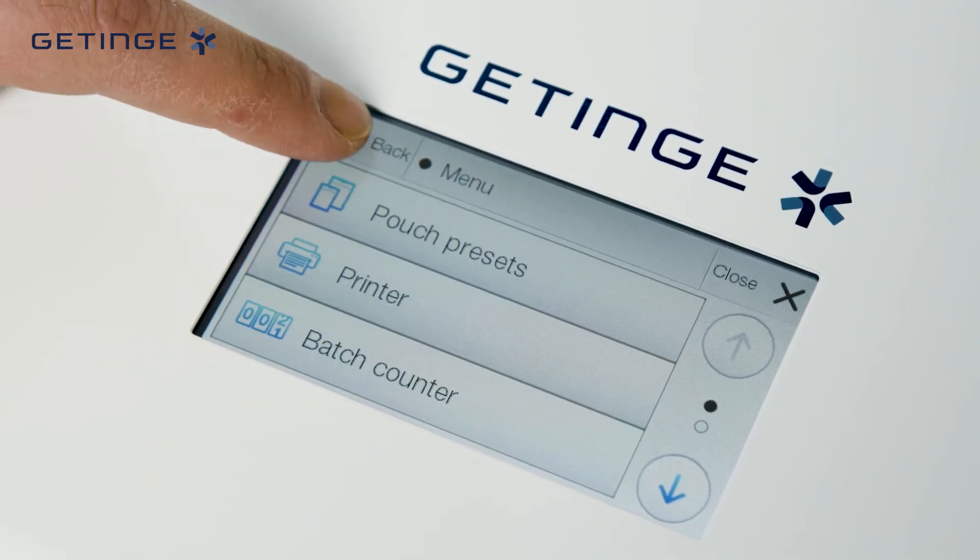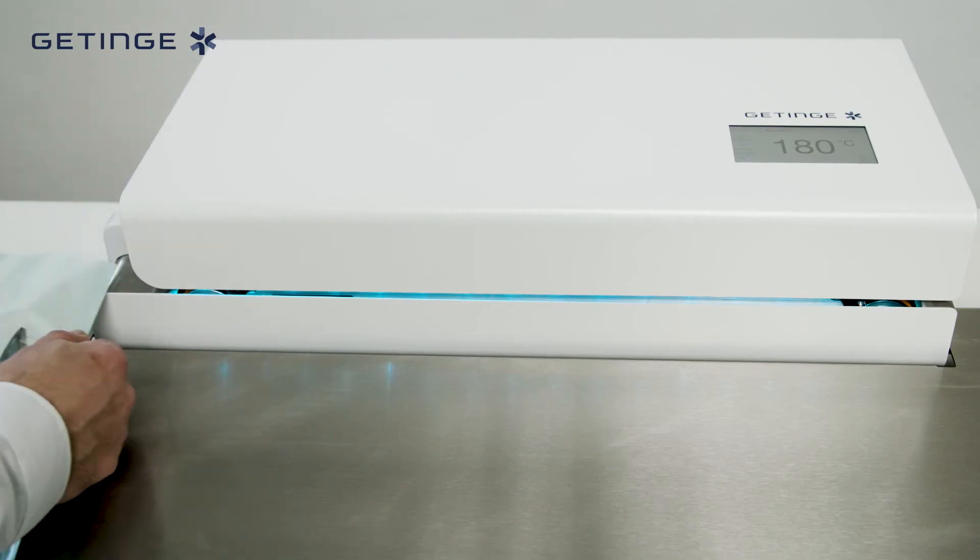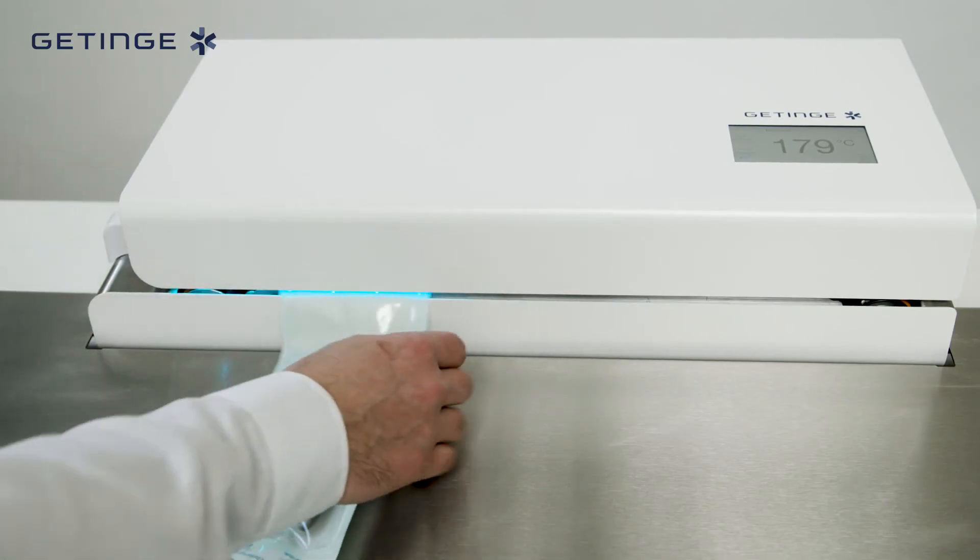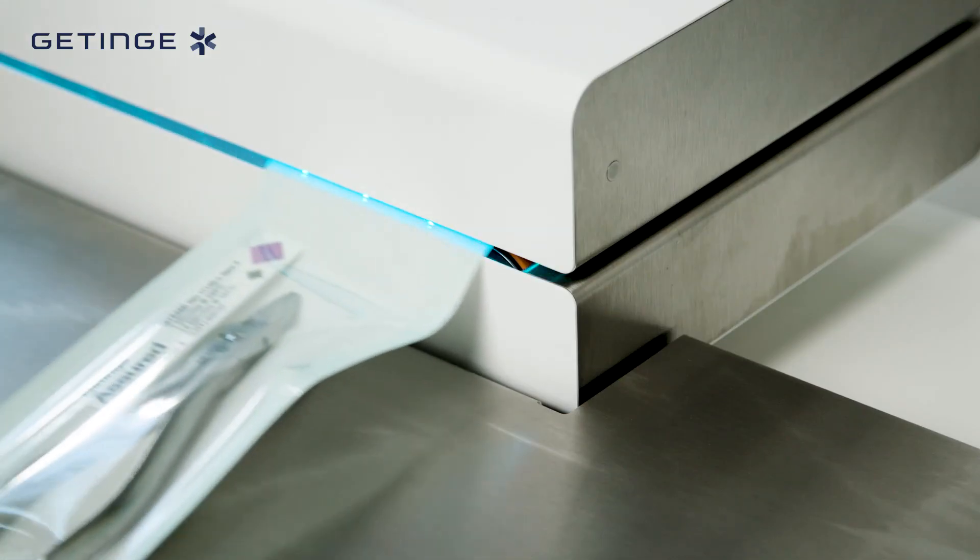The integrated printer on the ProSeal Premium model can print critical sealing parameters and user-defined information directly on the pouch for traceability.